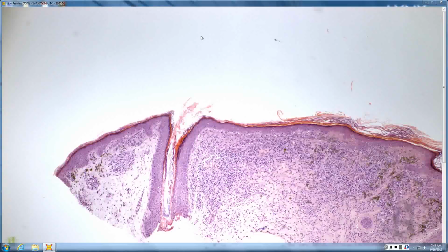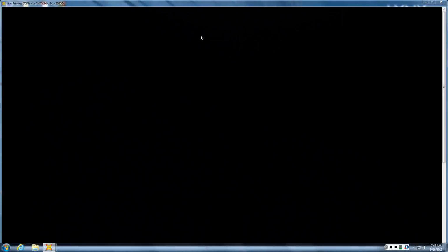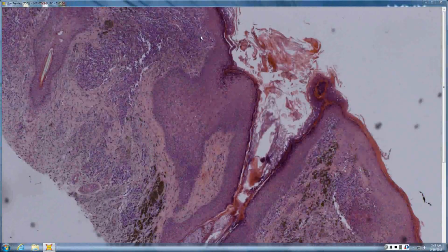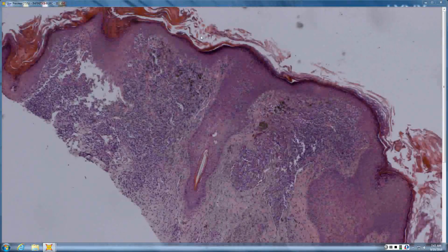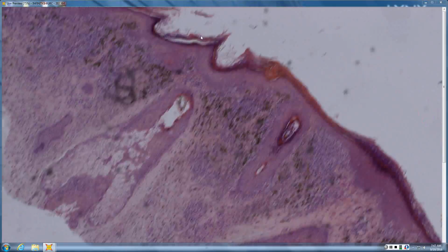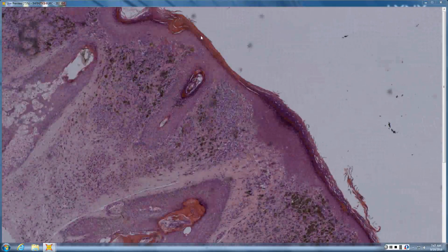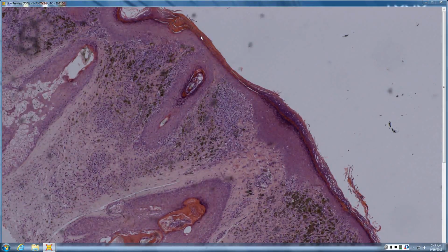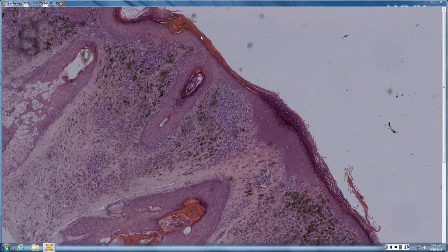So it's not quite a halo nevus. Certainly, you'd want to think of lichenoid regression in melanoma, but I don't really see confluent melanocyte proliferation along the DEJ. I agree. The overall architecture is of a banal nevus, so it could just be a lichenoid response to a nevus. Or just a twofer: two unrelated diagnoses hitting at the same spot.